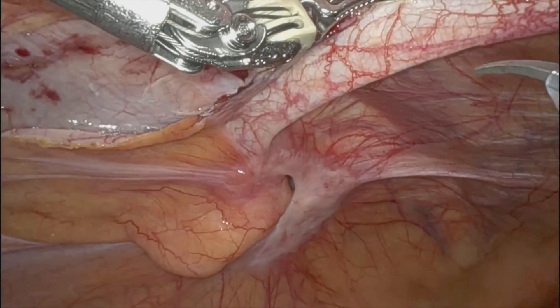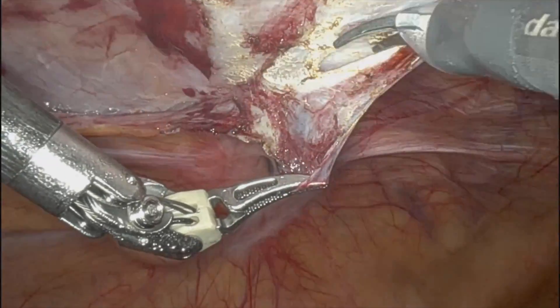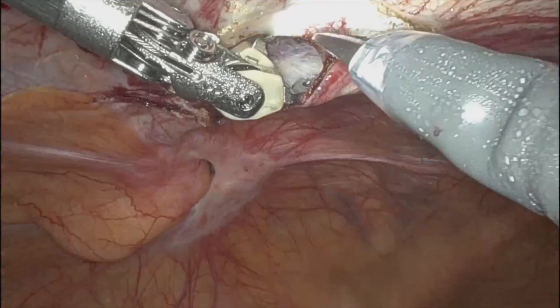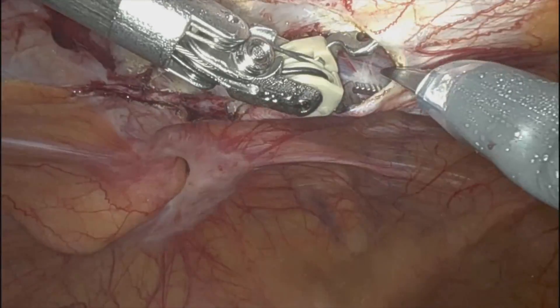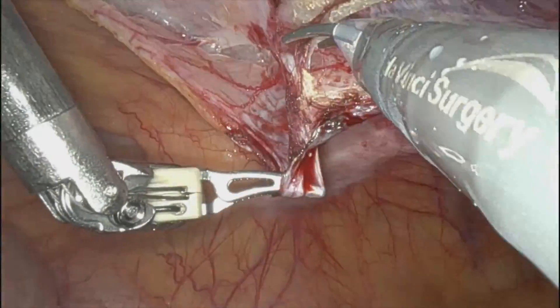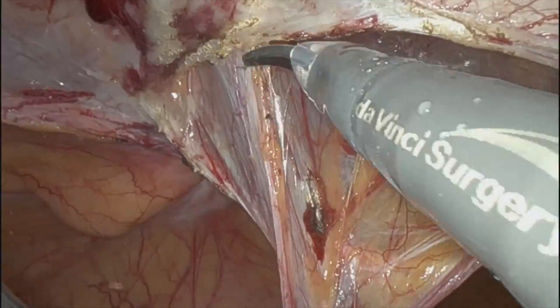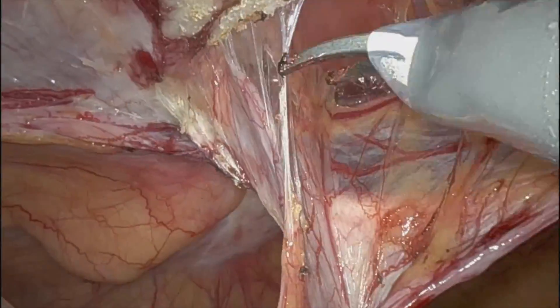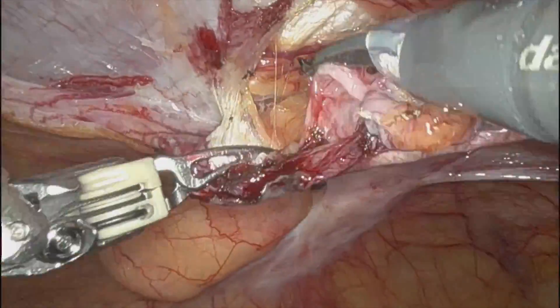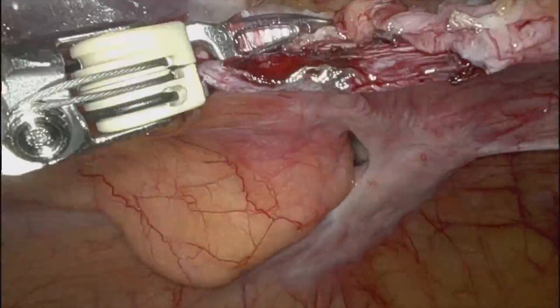You can see here I'm just trying to get a good window to get into the preperitoneal plane. And then I'm just connecting the dots between the lateral border of the rectus muscle and the medial boundary of the obliques. You can see the wide, bare area of the semilunaris.